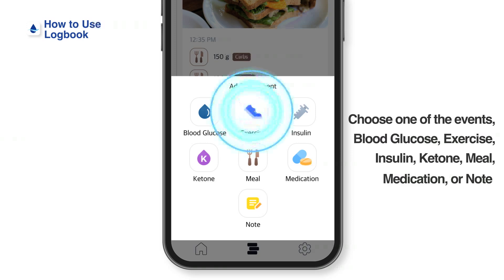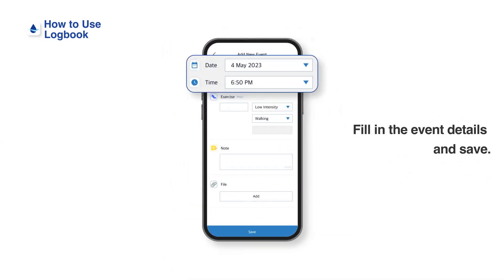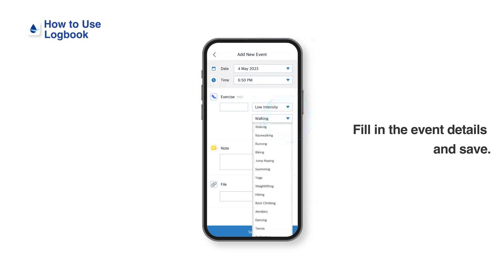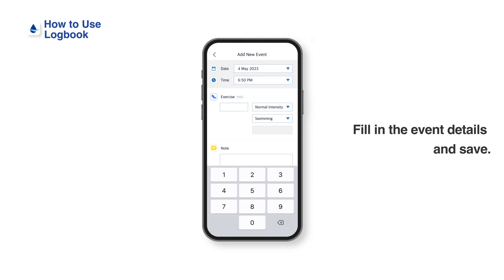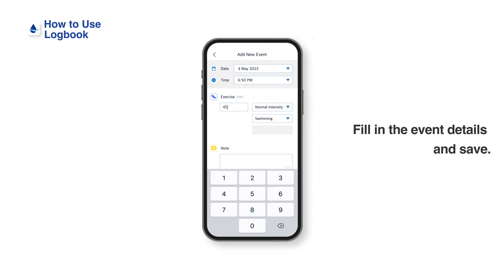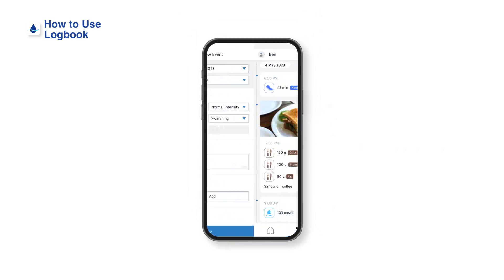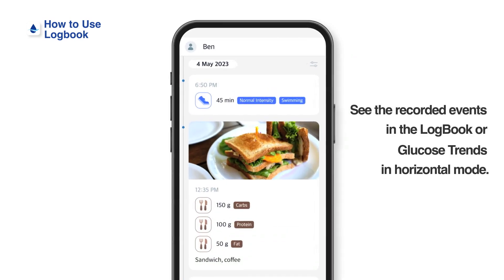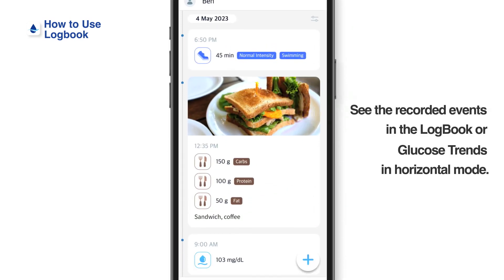The event record page will appear. Choose an event you want to record from blood glucose, exercise, insulin, ketone, meal, medication, or note. Fill in the details including the event time and date, then tap Save. The event is recorded. You can find the recorded events from the logbook or glucose trends in horizontal mode.